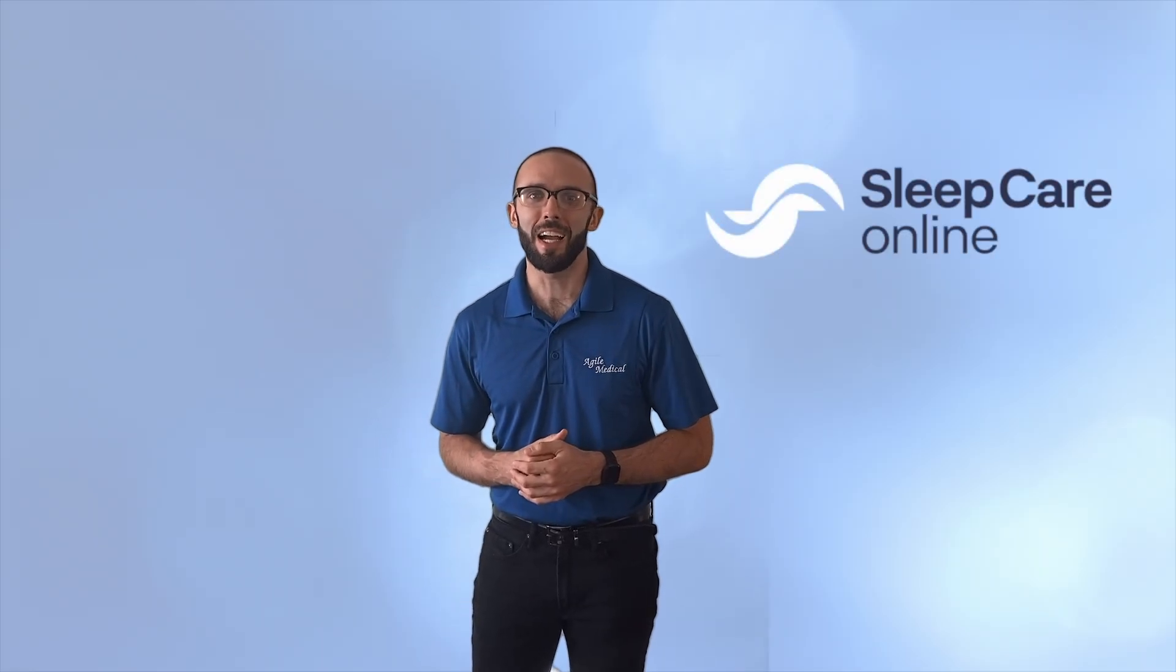Congratulations on receiving your new Night Owl home sleep apnea test. Hi, I'm Andrew with Sleep Care Online and I'm here to walk you through your first night with Night Owl.